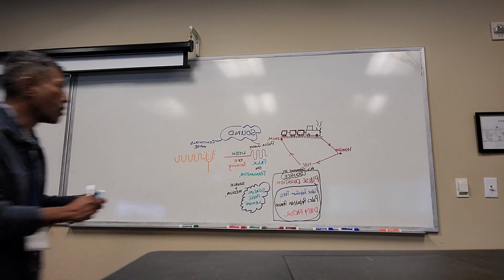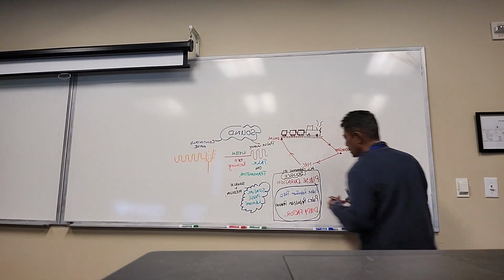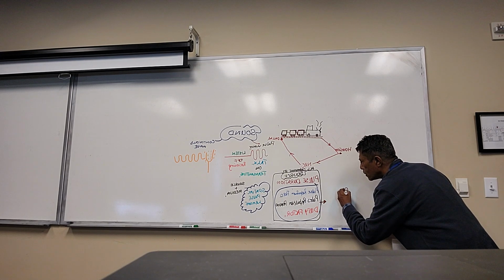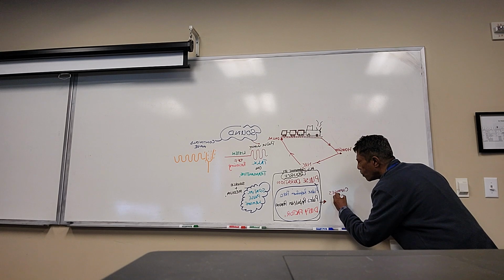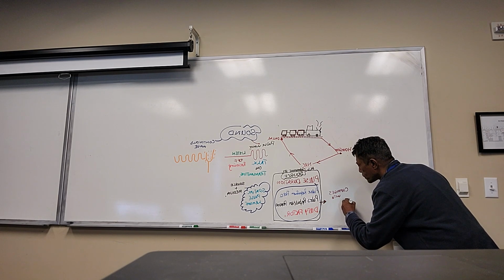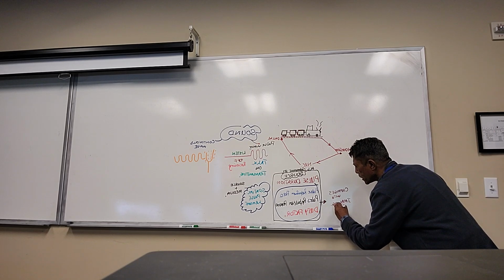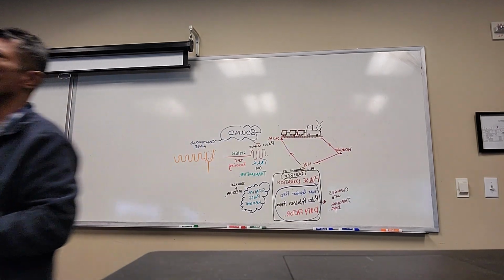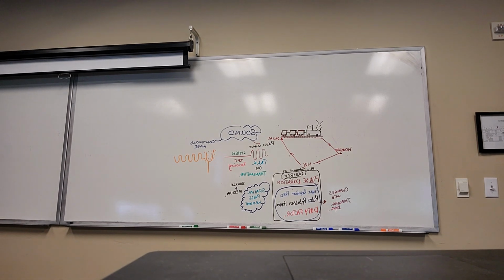So it changes with imaging depth. Now what's that supposed to mean? The deeper, the longer. The more superficial, the closer, the lesser.